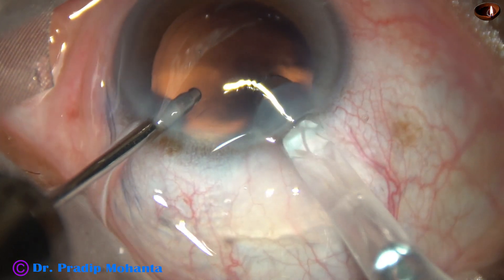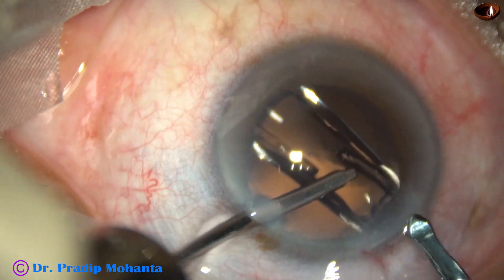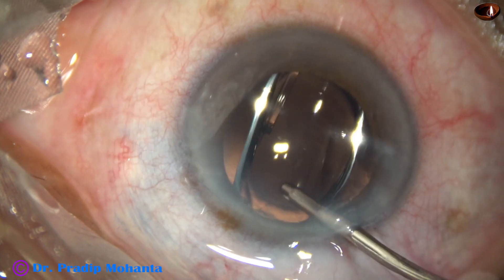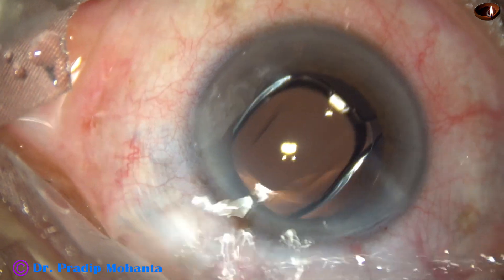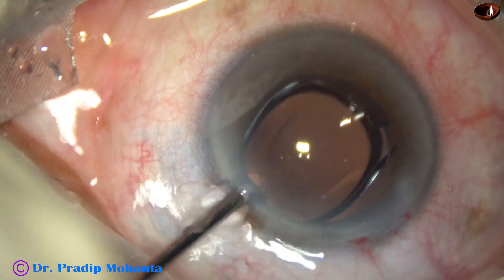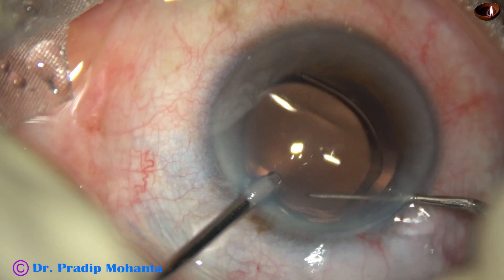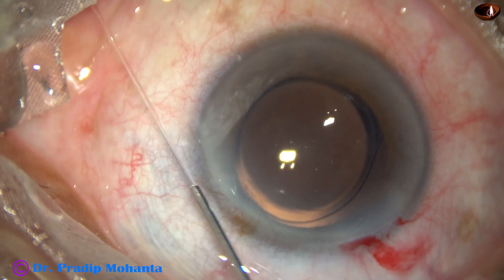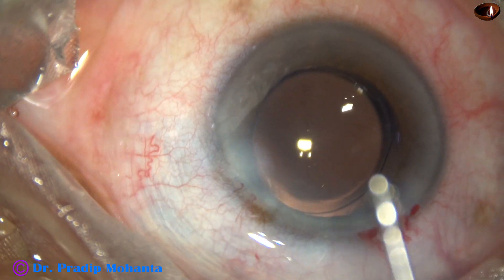Hydroimplantation of a single-piece monofocal intraocular lens is done. This is a hydrophobic lens and it easily went into the capsular bag. To check whether it is in the capsular bag, we take a Sinskey hook in the right hand and hook the capsulorhexis margin just over the haptic. If we can hook the margin, it means the haptics are in the capsular bag.